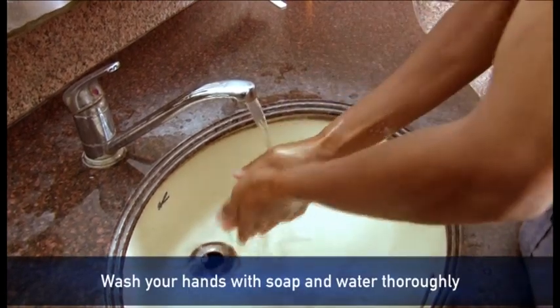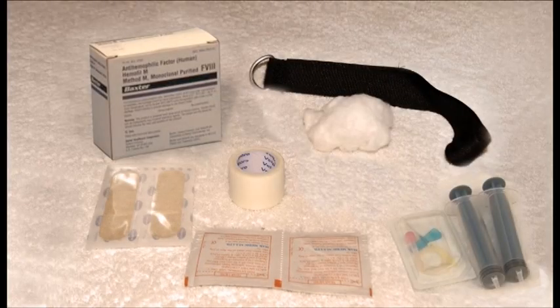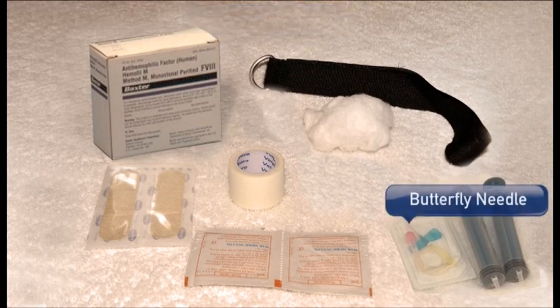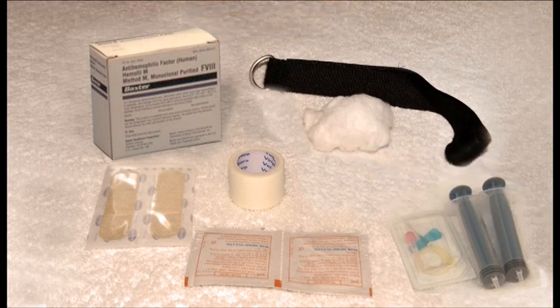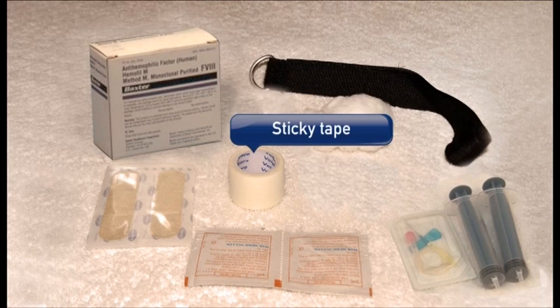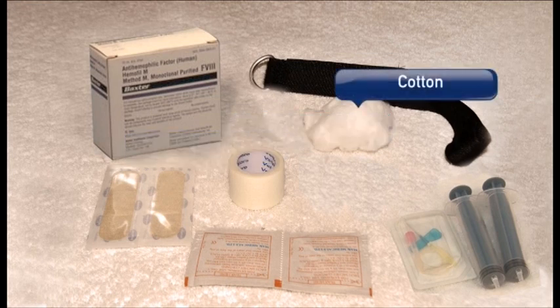Wash your hands with soap and water thoroughly. Get the material ready. The material should include: factor pack, butterfly needle, 10 ml syringe, tourniquet, two disinfectant alcohol swabs for disinfection of the vials, sticky tape to keep the butterfly needle in place, adhesive bandage and cotton.